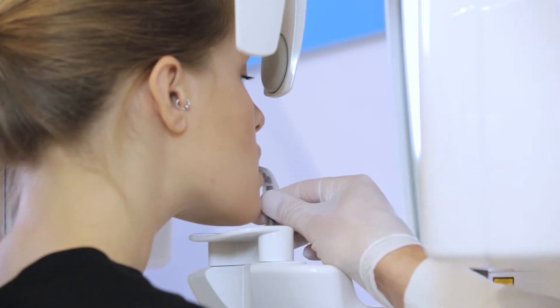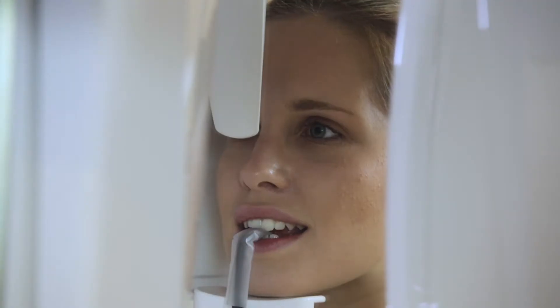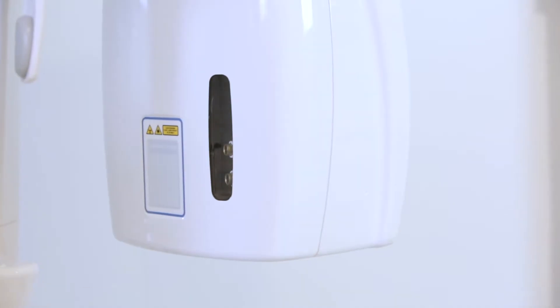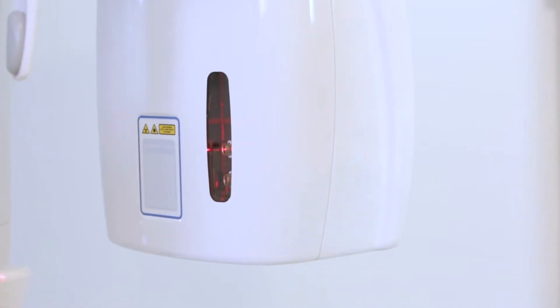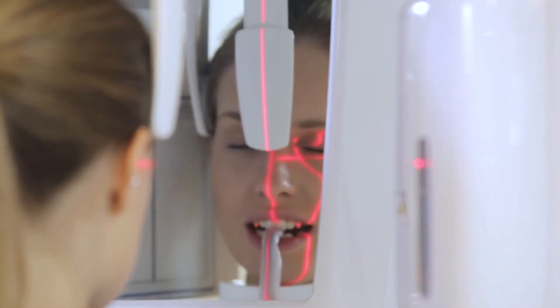By adjusting the height of the bite, the dentist asks the patient to make sure her incisors are in the groove so that the incisors' interproximal space is aligned with the bite's midline. To ensure maximum positioning accuracy, laser beam projections on the patient's face are needed.